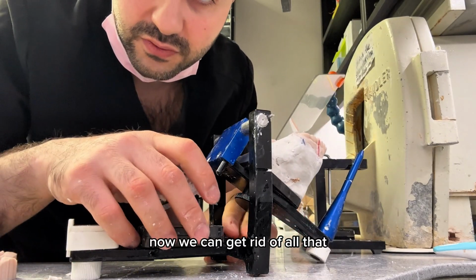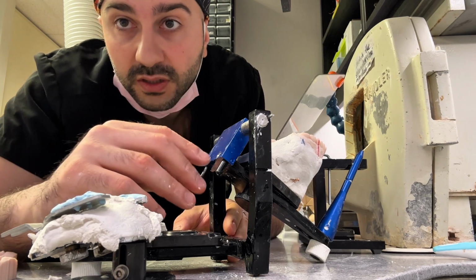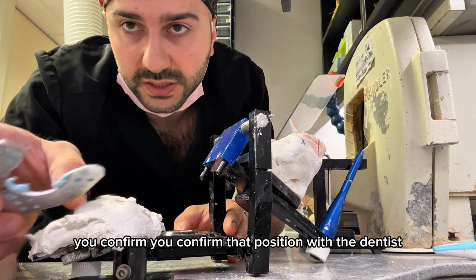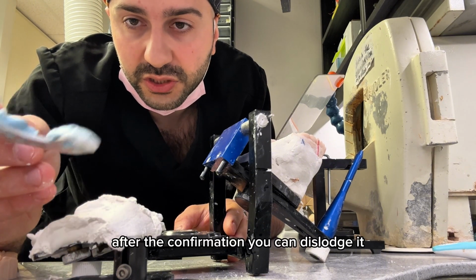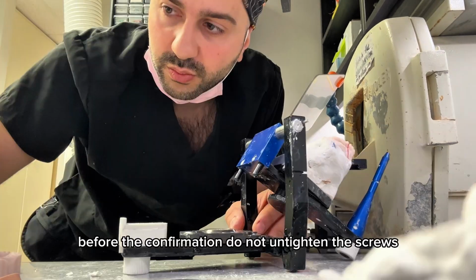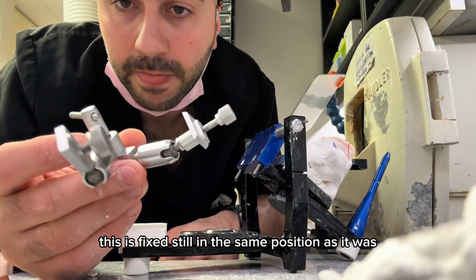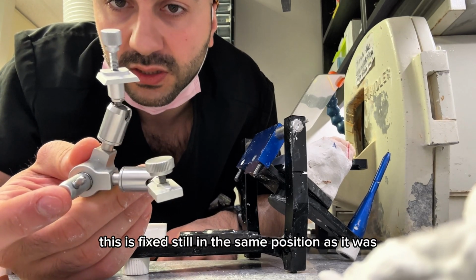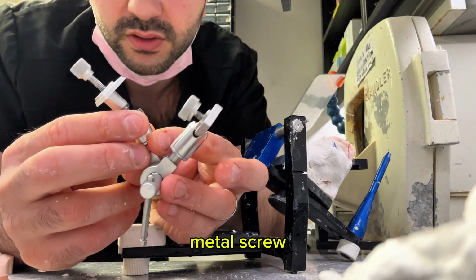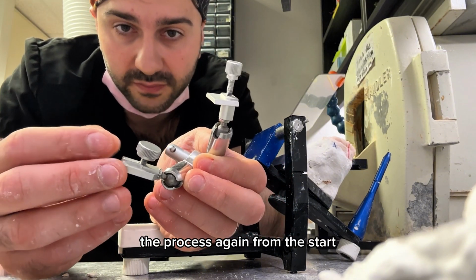So now we can get rid of all that. When it's mounted and it's confirmed, whether you work with a dentist, you confirm that position with the dentist. After the confirmation, you can dislodge it, dismount it, and break it, okay? Before the confirmation, do not untighten the screws. This is fixed, still in the same position as it was. This is why it is important not to touch this middle screw, in order to be able to replicate the process again from the start.